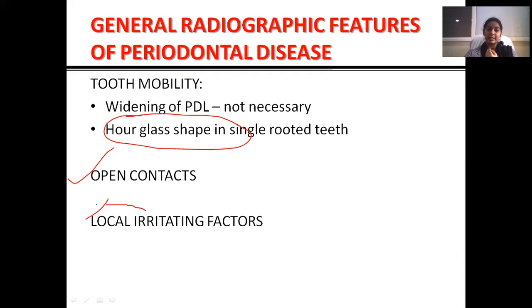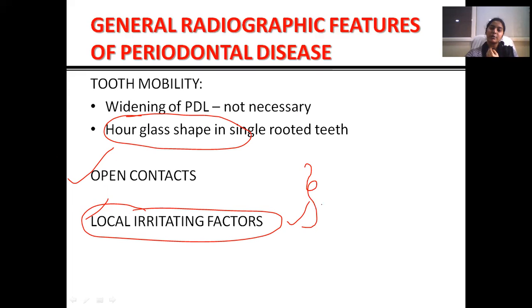Local irritating factors like calculus can also be noted on radiographs, as can overhanging restoration margins. But an important point is that these open contacts and local irritating factors can even be appreciated clinically. So for those findings which can be appreciated clinically, we need not take radiographs again.